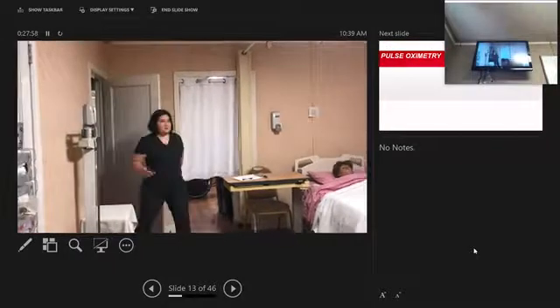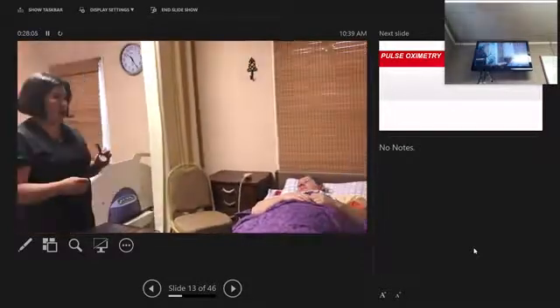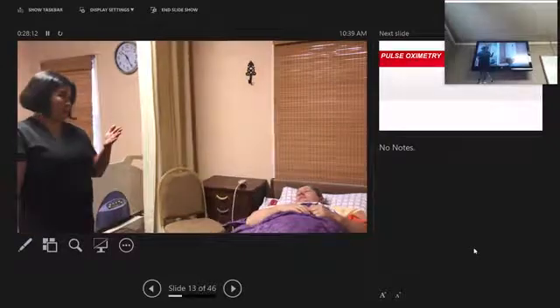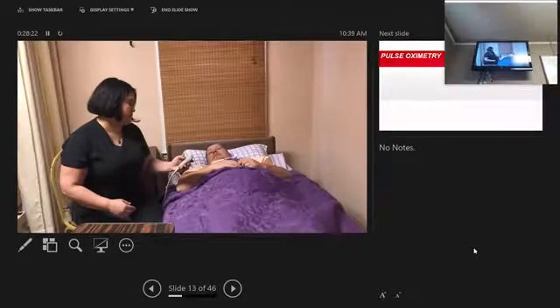Come in. Hello, everyone. My name is Tanya. I'm going to be your CNA today. I'm going to get your vital signs on here. We're going to do your respiration first. The supplies I need for this are going to be my watch with the second hand and a recording pen and paper. Watch the clock on the wall.